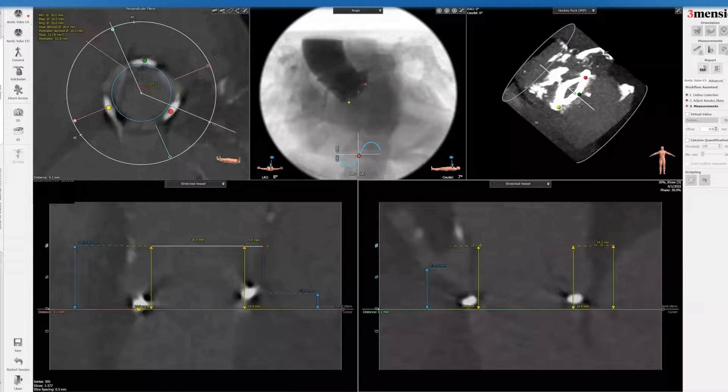Remember, if you use a balloon expandable valve — particularly if you're going to oversize quite a bit, especially at 23 millimeters — these leaflets can flare outwards, actually increasing the coronary obstruction risk even more. So keep that in mind when measuring. This is not necessarily the final length; it's a conservative estimate.